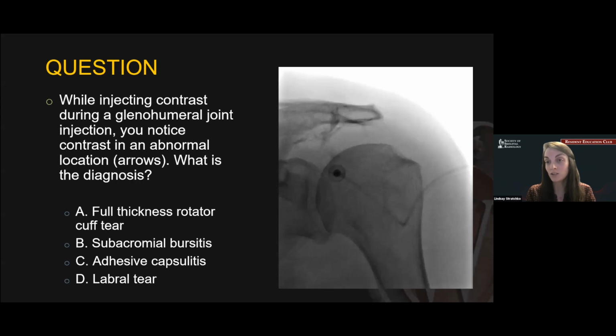And then the other thing is too, if I do have a patient that has a bad rotator cuff tear and a really high riding humeral head, if the patient can relax their arm down, I find that can often be helpful to bring everything into a somewhat more anatomic alignment. But even if that's not the case, I'll still try and maintain more of my glenoid landmarks rather than high up on the humeral head, which I found to be pretty helpful.